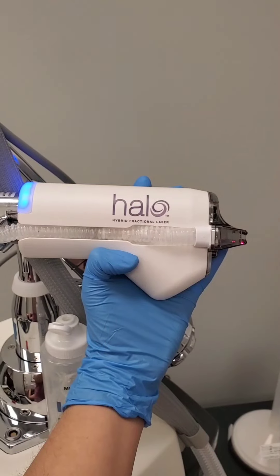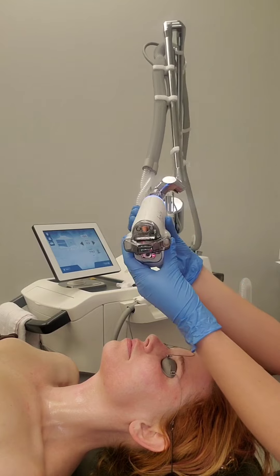Hey guys, I'm esthetician Trish McCartney. I work in Huntington, West Virginia with Marshall Plastic and Reconstructive Surgery. Today we're going to talk about the Halo Hybrid Fractional Laser.